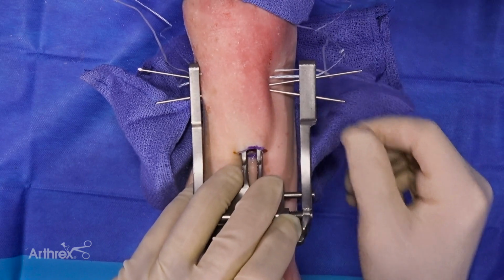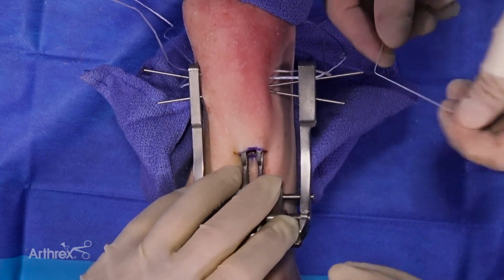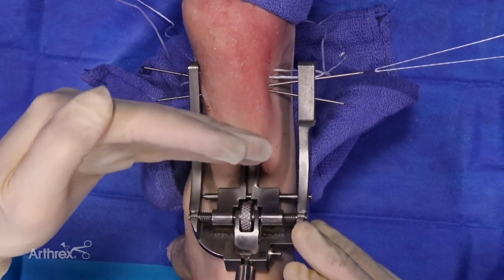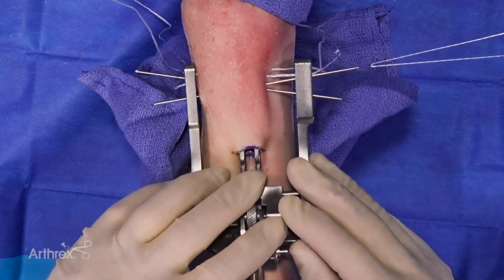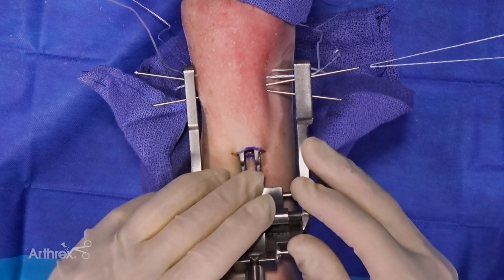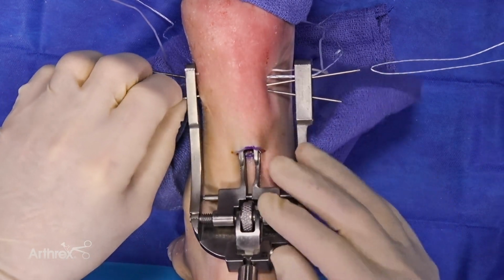And number 3 and number 4 are utilized for our lock suture technique. If you didn't want to lock on either side of the stump, you could just go position 1, 2, and 5. But in this situation, and routinely, I always use at least 1 lock suture on both sides of the rupture itself. So in this situation, we're demonstrating this in holes 3 and 4.